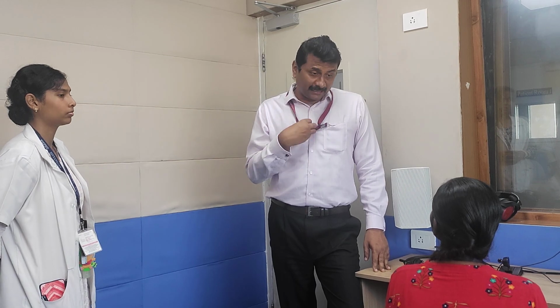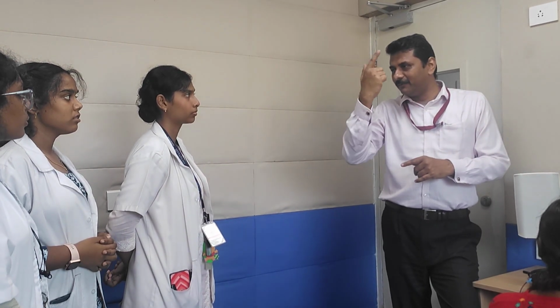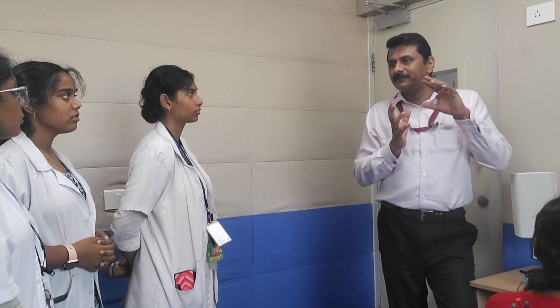If you get an opportunity to buy just one machine, audiometer, immittance, ABR, otoacoustic emission, VEMP or anything, just one machine can be purchased, then the only machine which I would prefer to purchase is a pure tone audiometer. Remember, it's a subjective test, but you can test across the frequency, across the intensities, both the ears separately, put the bone conduction. That gives you the type of hearing loss and the degree of hearing loss, right?